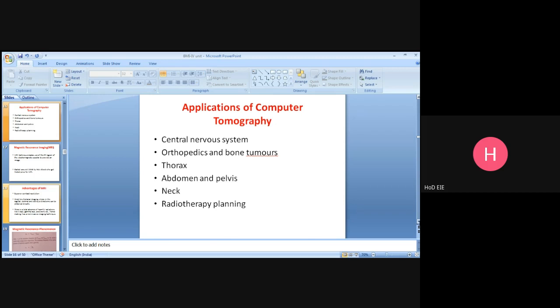That is the dynamic imaging after contrast, which is very helpful in the evaluation of vascular lesions as well as the differential diagnosis of malignant and non-malignant lesions, and the subdiaphragmatic space as well as peritoneal cavity lesions can also be evaluated.